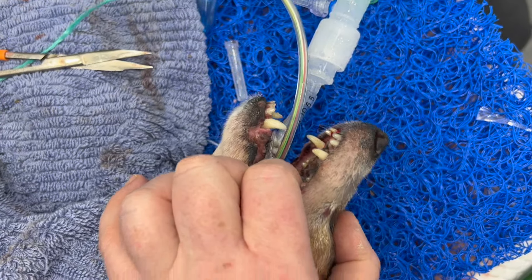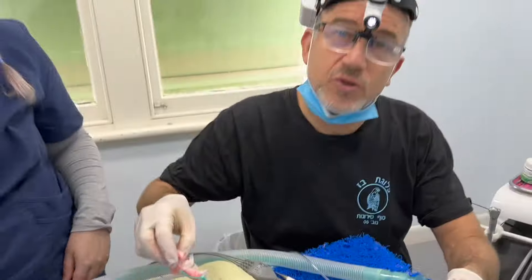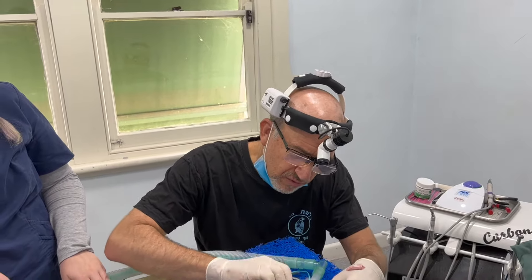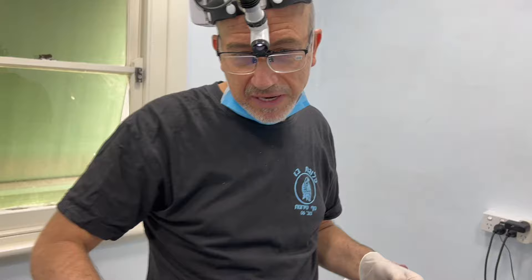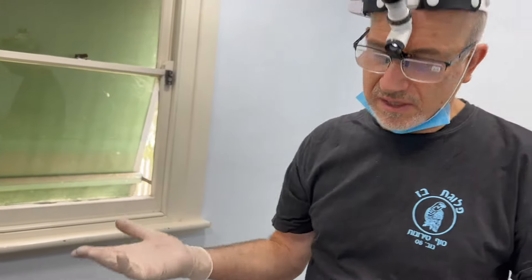Let's look at the other side and see how much we can do. Our dental procedures are one hour, and we're about 35 minutes in, so we still have time to work on the other side. The cost of this particular dental procedure is about $800. Whether you think it's expensive is up to you, but it's an anesthetic, it's staff, a lot of equipment, and a lot of experience.